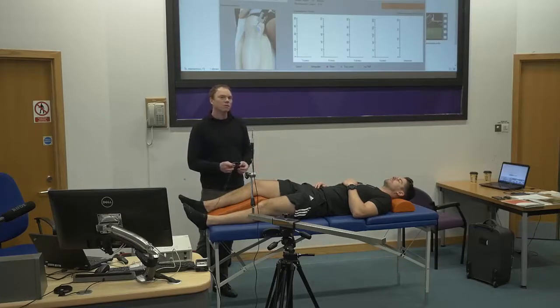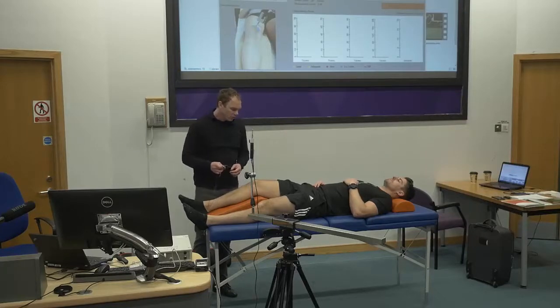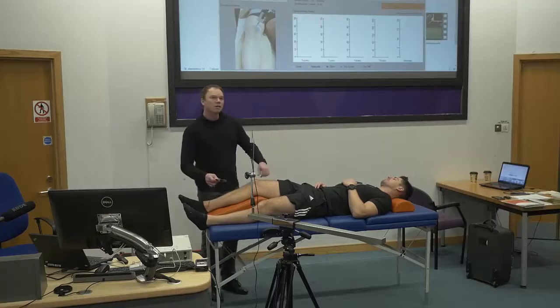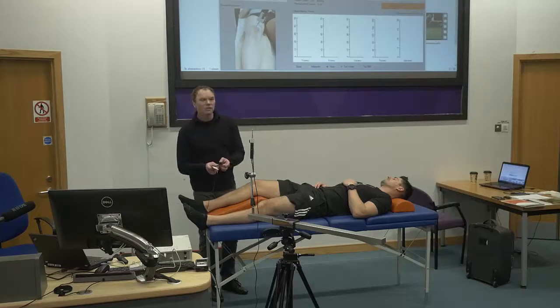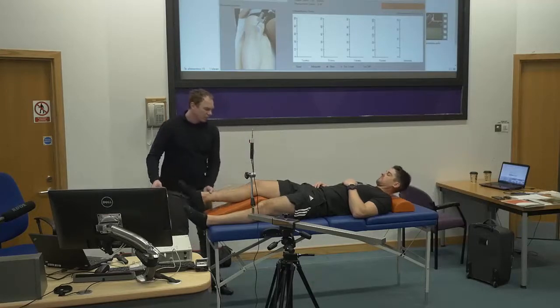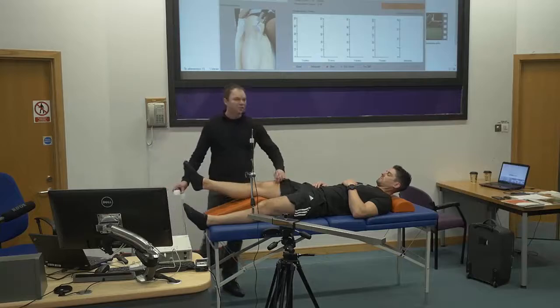You will understand where you should position the electrodes before the measurement. We will start with the medial head — the vastus medialis muscle. I know where it is, but in order to position the electrodes more easily, I usually ask the subject to contract. You can probably see these are the borders of the muscle belly.